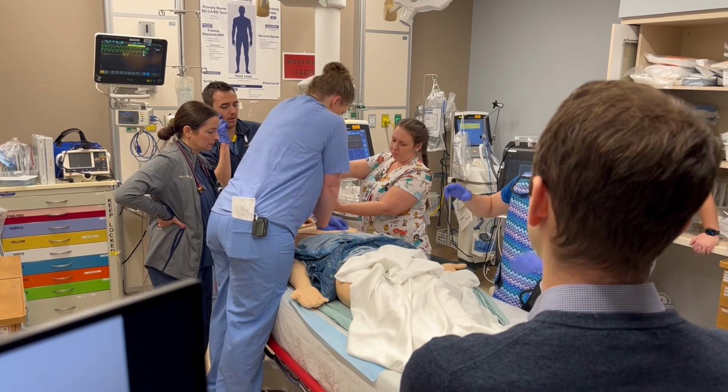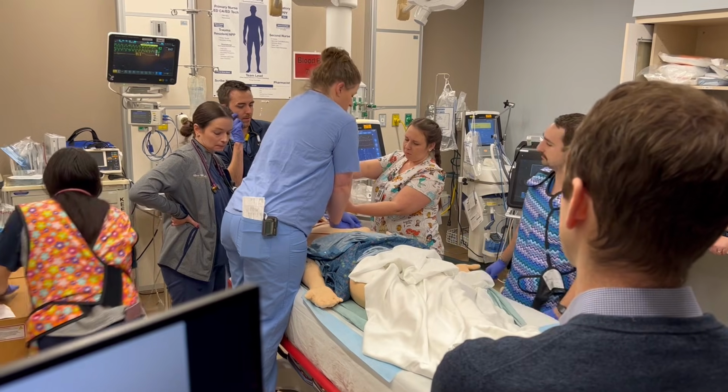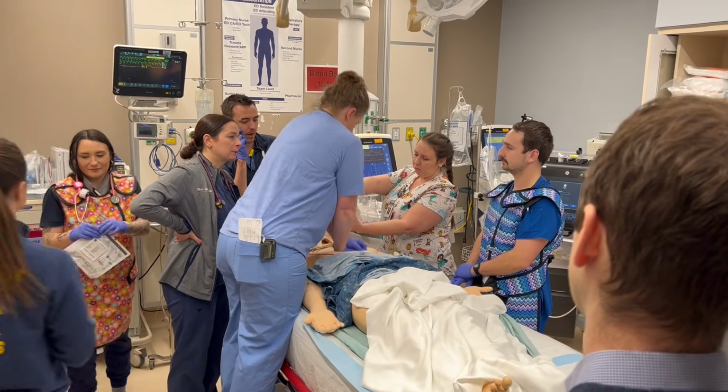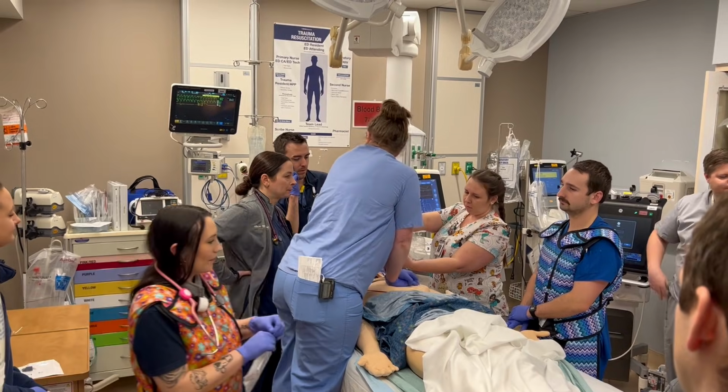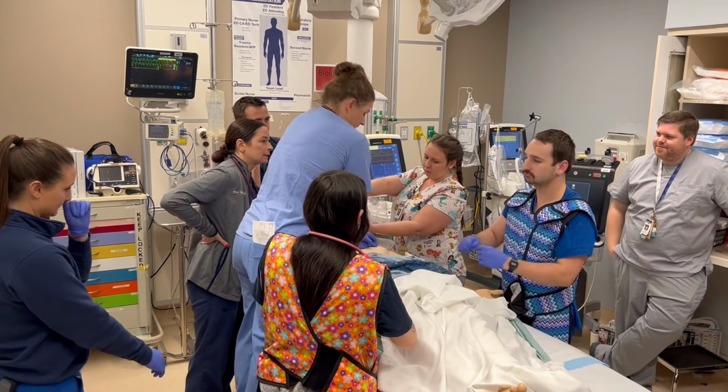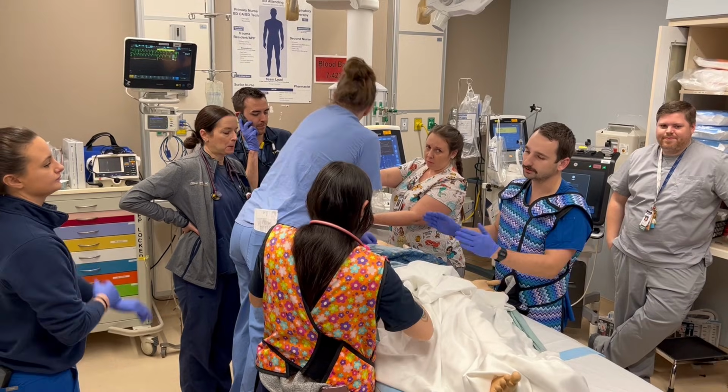Okay. You want to grab that? Oh, yeah. I'm working with compressions with someone. Who's next in line to do compressions? We'll take them out when we want. Okay. Yeah.